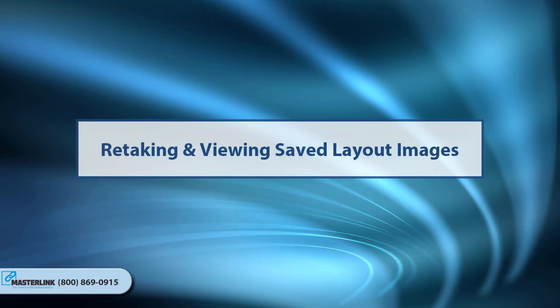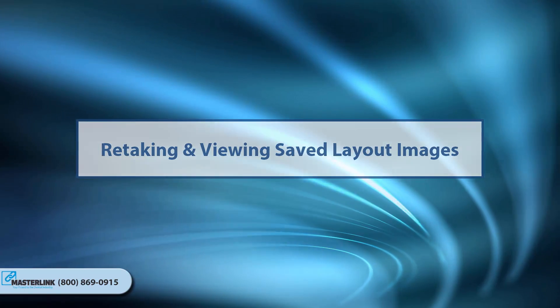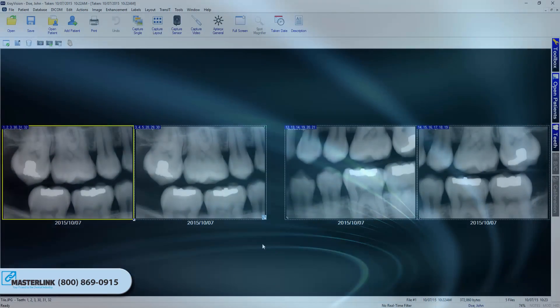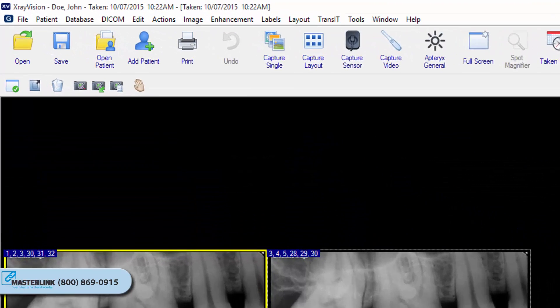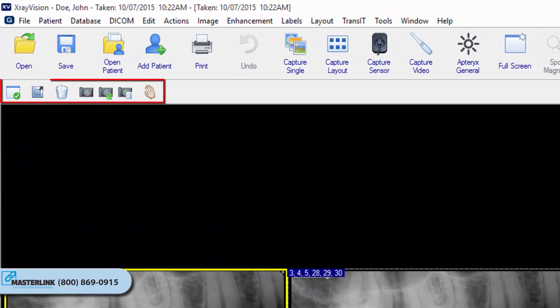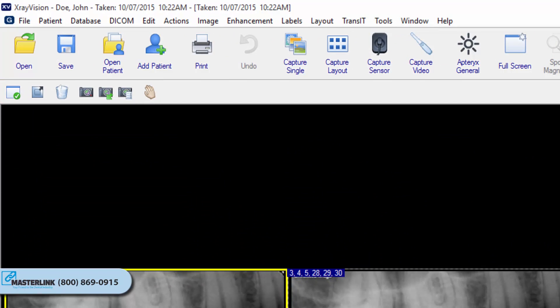Retaking and viewing saved layout images. In addition to retaking images during the initial capture sequence, the user may add or retake layout images after the layout has been saved in the database. At the top of the layout view window, there are several buttons to control image viewing and capture.